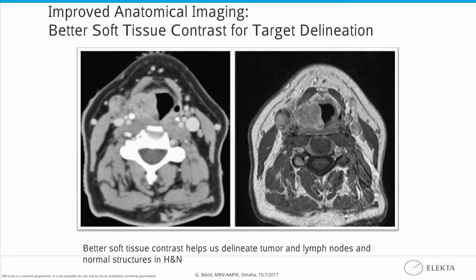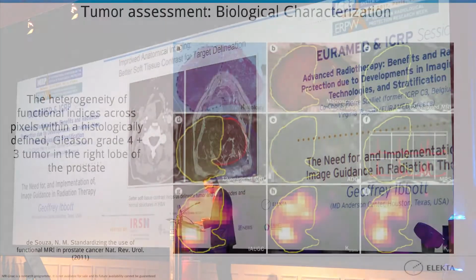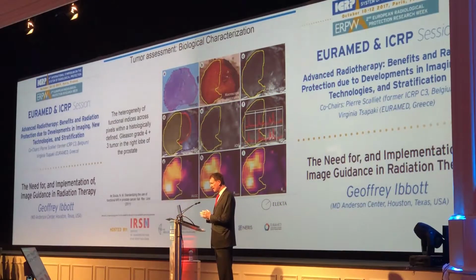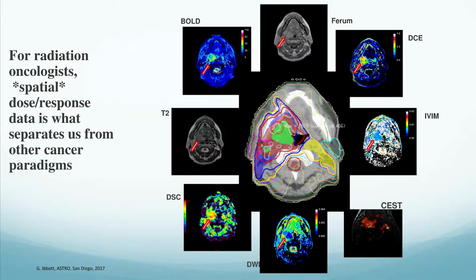Dr. Gregoire showed you some examples, and here's another. On the left, our CT scan shows us that there is something there blocking that air cavity, but on the right, we can really see the extent of the tumor in the oral cavity, and we can also see an enlarged lymph node. Even I can see that on the MR. And with advanced pulse sequences, here an example in the prostate, we can get much more information about function and learn about the tumor itself, where tumor cells are actively growing and where they're not, with spectroscopy and other imaging techniques, such as some of the ones shown here.